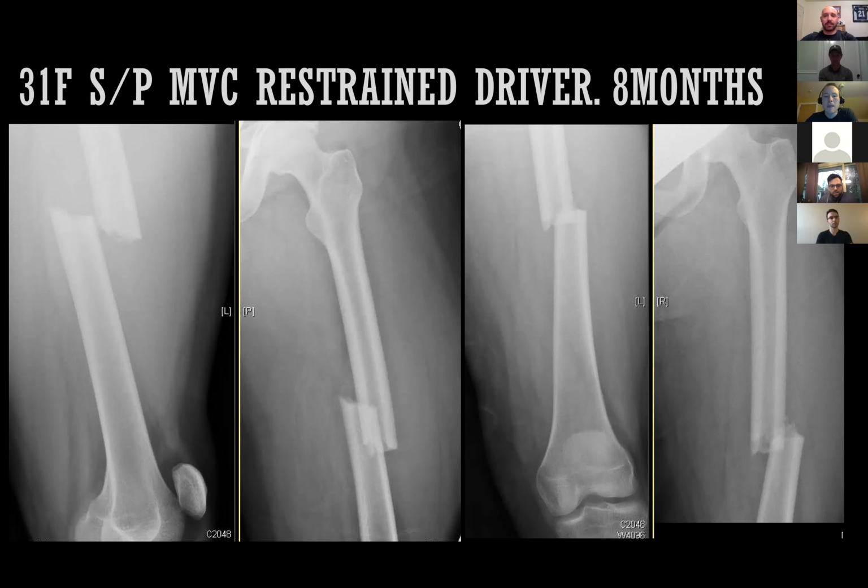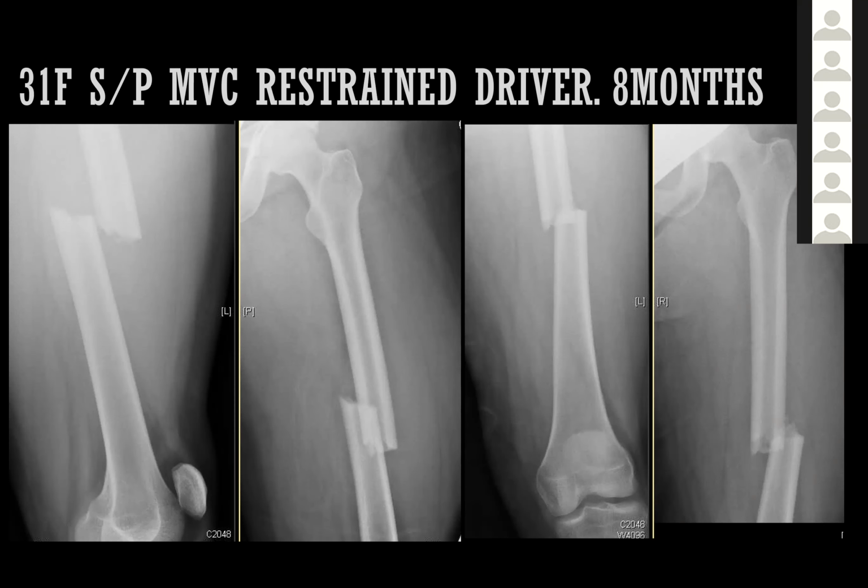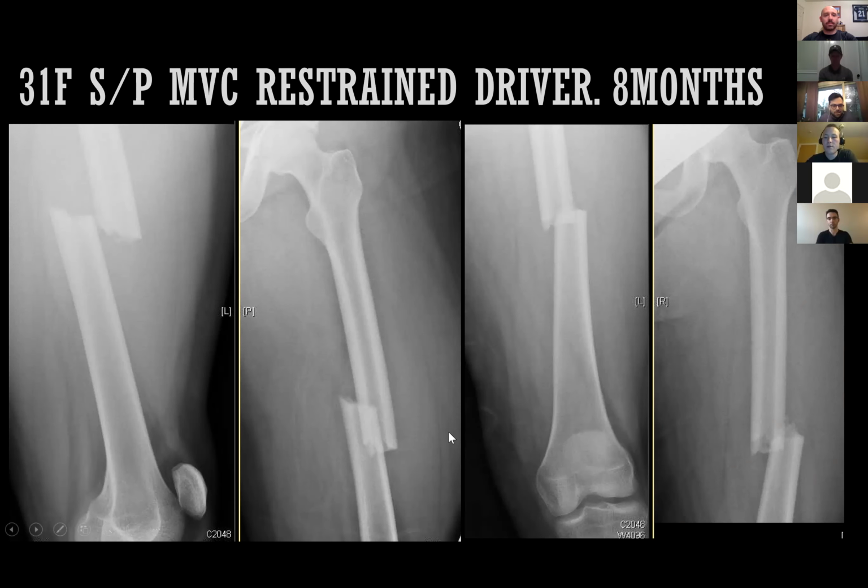With a transverse midshaft femur fracture, posteriorly displaced and medially displaced. It's actually a little bit laterally displaced. Very confusing given the fact that you're looking at multiple views, but I think this view here is the one that kind of gives it away to you. It's posteriorly and laterally displaced. Simple. Good. Excellent. In addition to the displacement, it's translated posteriorly and it's translated laterally.